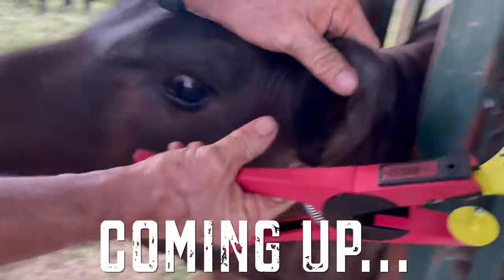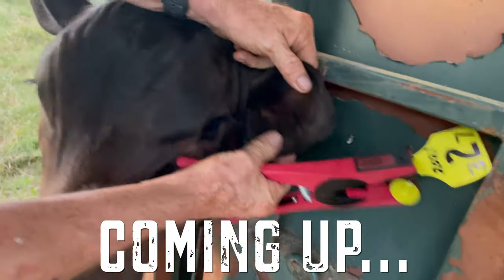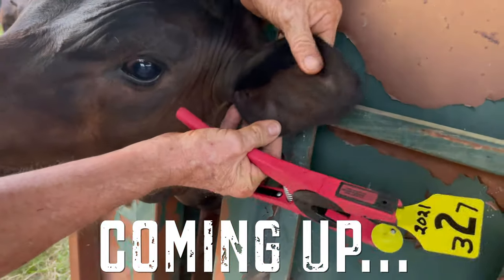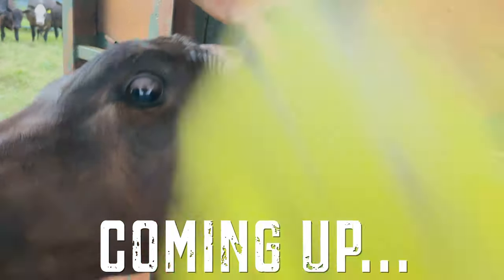Look at the two ear cartilage markers we just set. They look like little ropes — one here, one here. You want to put it right in the middle of those two.